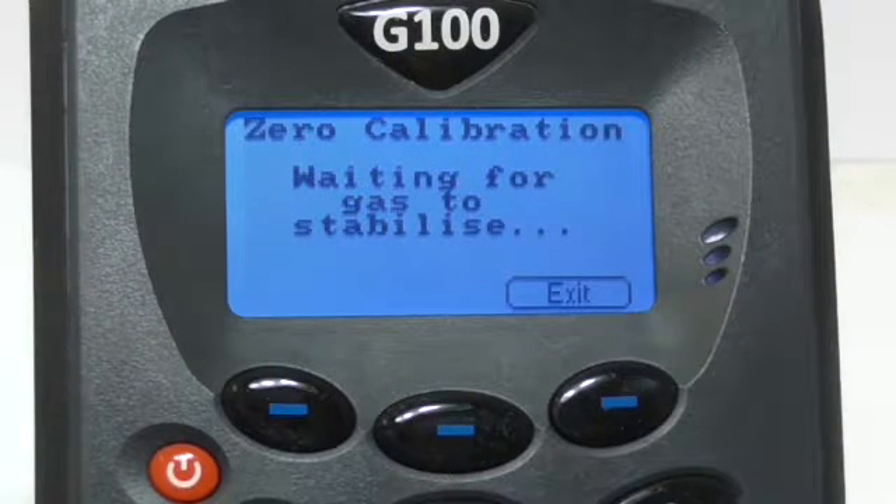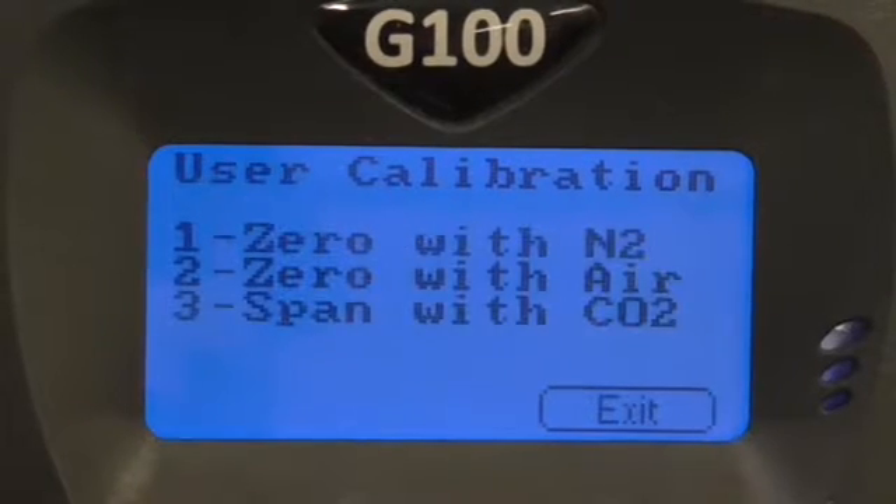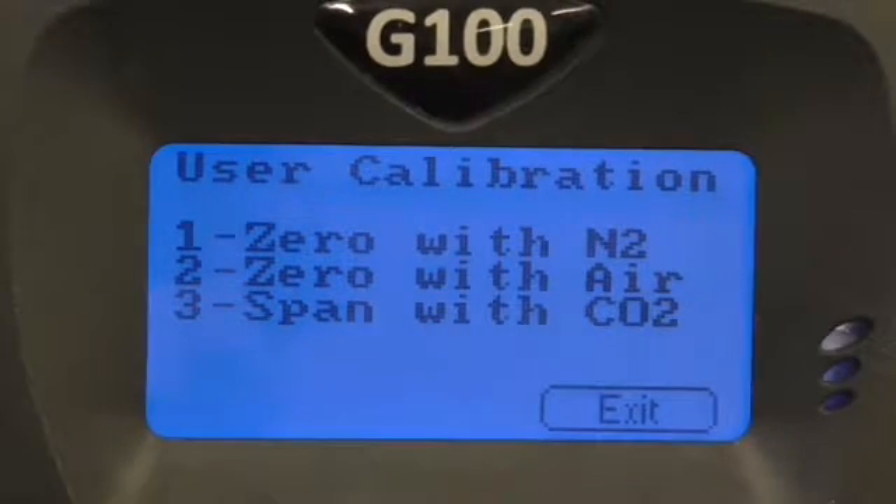After, press start and wait for the gas to stabilise. Shortly after, a message should appear indicating the calibration has completed OK, so press accept. You have now zero calibrated your instrument.